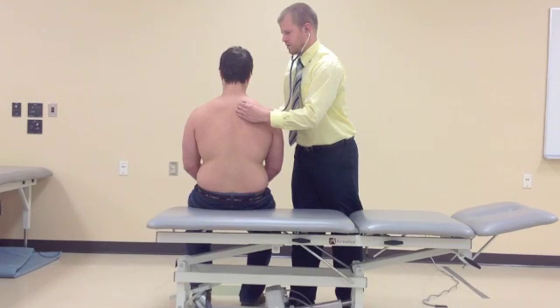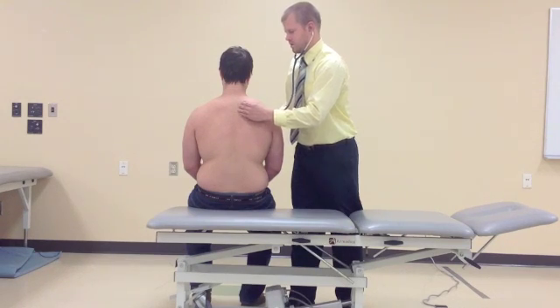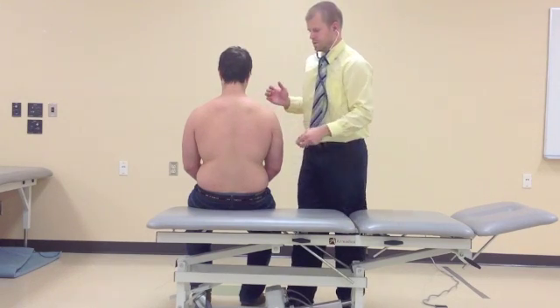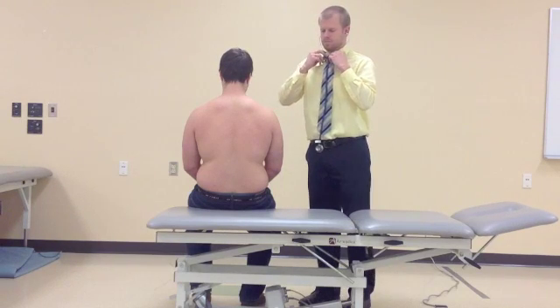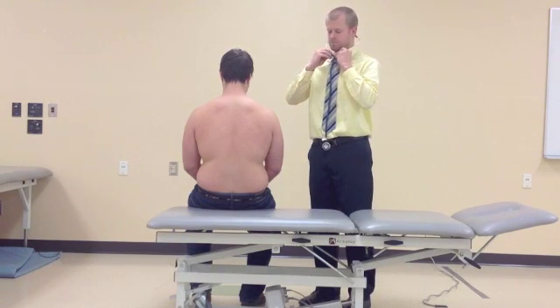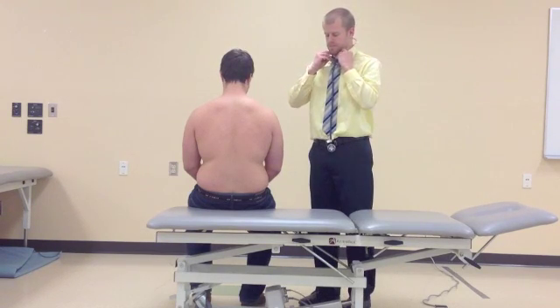Make sure your patient is not lightheaded or dizzy from the breathing. If the patient is okay, you are ready to move on to the sides of the lungs.